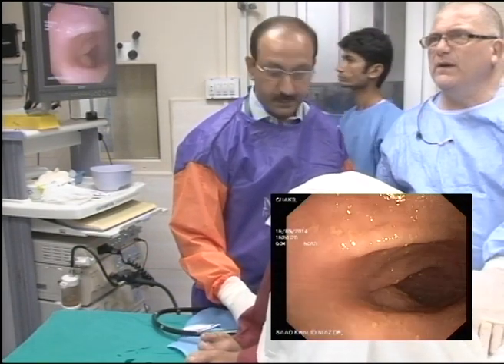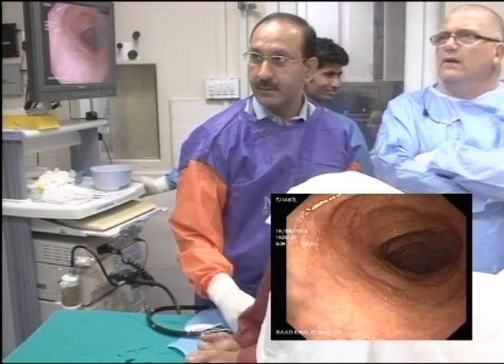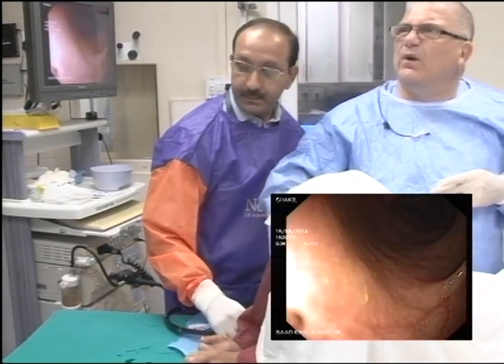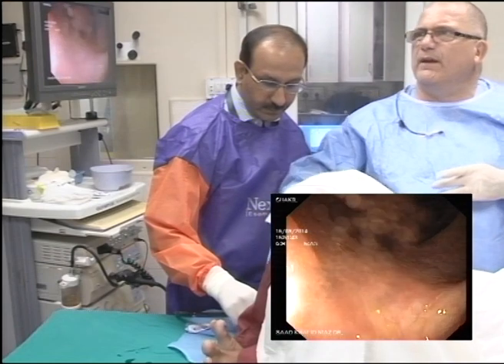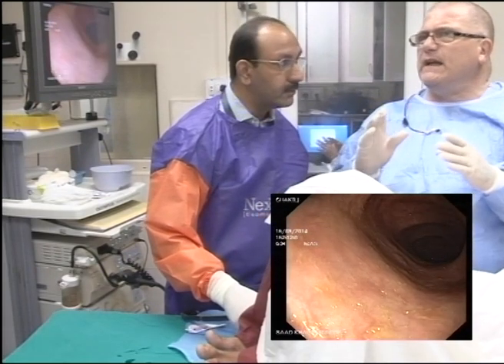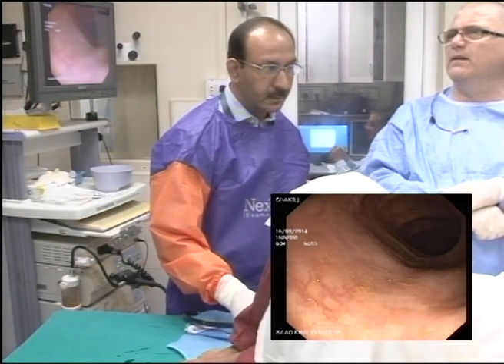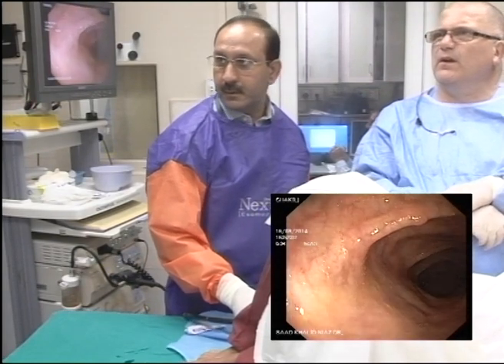And judging by his tummy, if I press just gently, I'd say we have got a large sigmoid loop. Now just drawing back the scope that way isn't going to help. So draw back the scope, hold it there, anti-clockwise, and now go forward just a little bit slowly. You're trying to put clockwise torque on, my friend. Just take it back nice and steady and advance slowly. The bowel will take a little bit of pressure if you put it in slowly. It's when you put it in fast that it shocks him, and then you get a lot of discomfort. So slowly advance. That's brilliant.